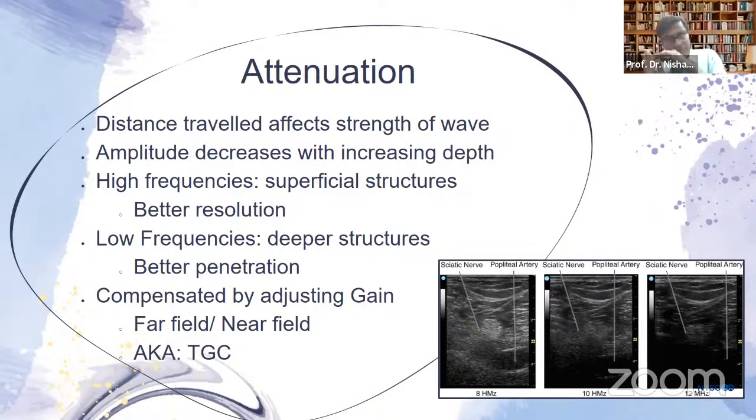So if you recall, if you have used your ultrasound, the linear probe provides sharper images. It is a higher frequency. It is used for superficial structures. Even if you see the depth matrix, it is up to only 6 centimeters. Whereas when we use the abdominal or the curvilinear probe, the frequency is lower. It is 2 to 5 megahertz, and the penetration is up to 30 centimeters. So you can see the deeper structures, but then again, the clarity is lost.